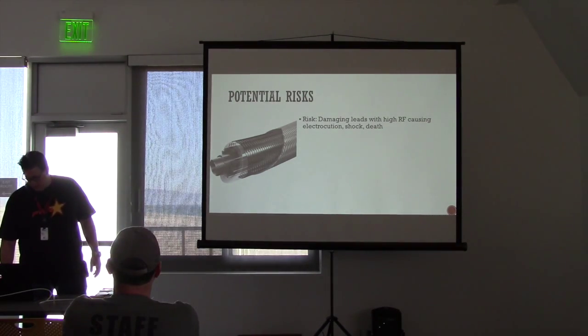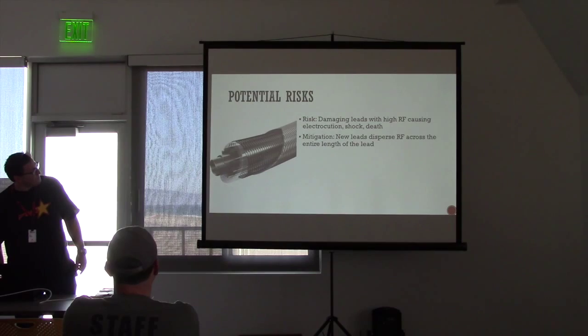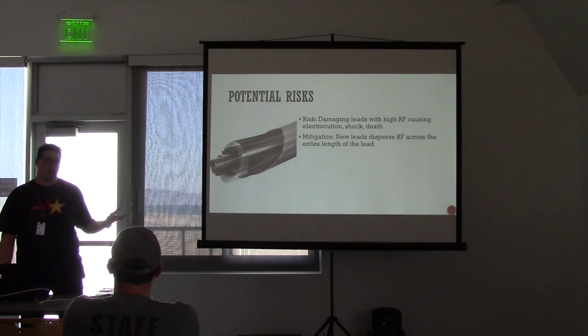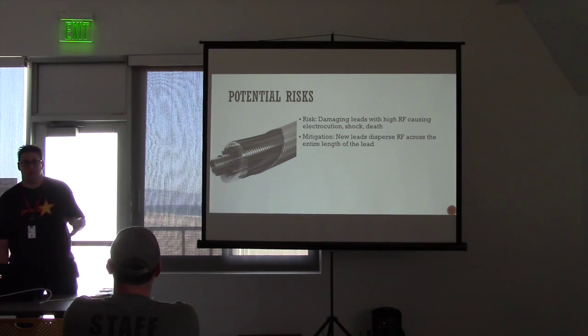I mean, as you see, there's basically a mesh of wires. So new leads disperse RF across the entire lead. There was a lot of extensive testing of this because of the damage that had been caused, not by malicious things, but by interference from other devices around those affected devices.